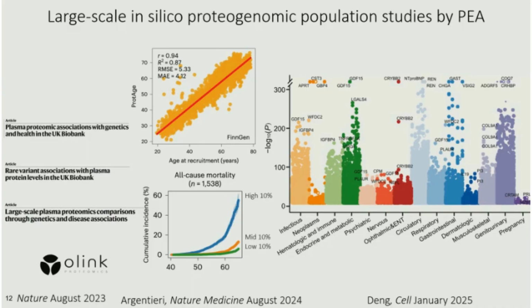So in the middle panel, you see 200 of those 3,000 proteins turned out to correlate strongly with age. So you could tell the age of a person, but you could also tell the little yellow spot above the diagonal. I really should have a pointer laser I could use.